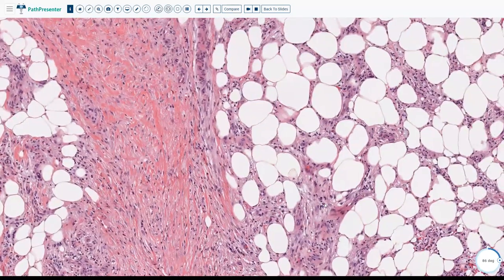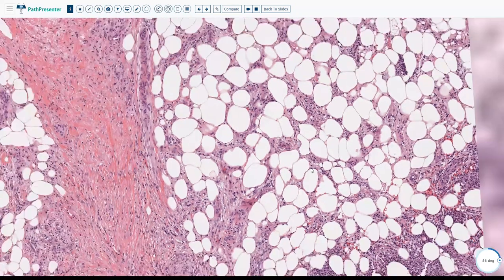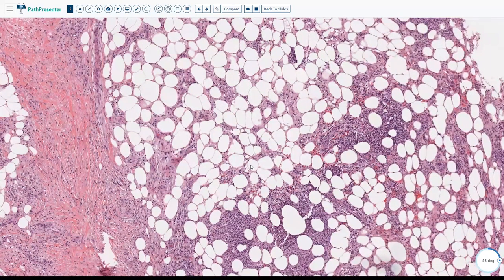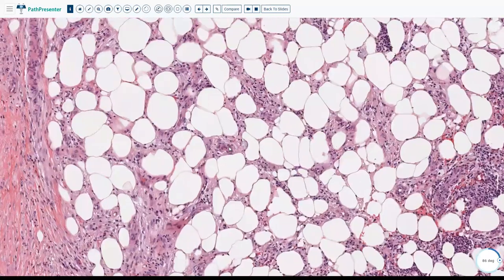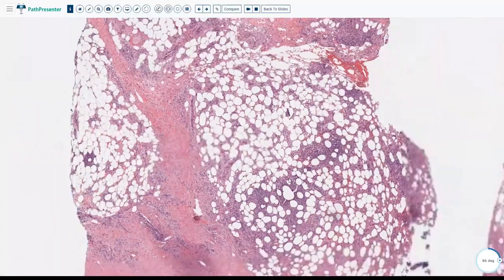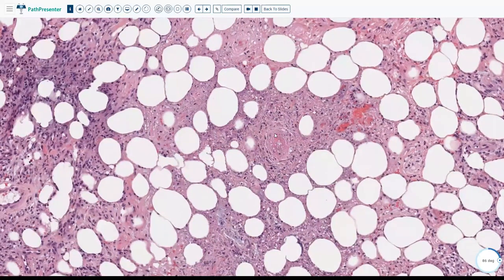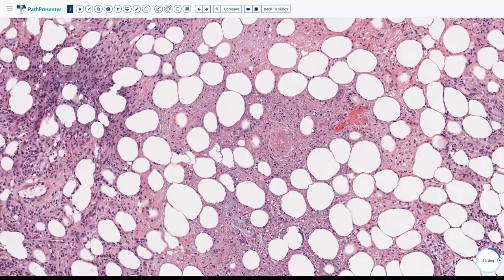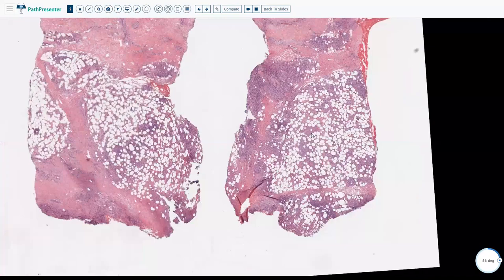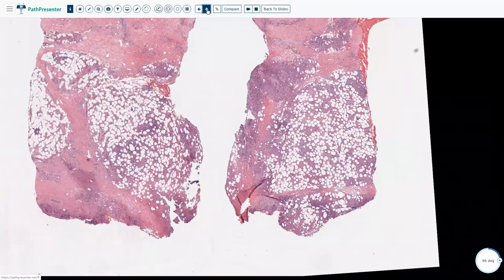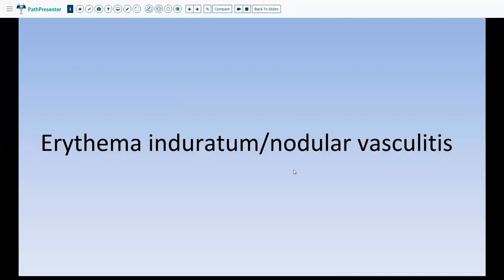When you see neutrophils associated with a lot of macrophages, you need to look for vasculitis. Going to high power, there is actual vasculitis with fibrinoid degeneration around the vessel wall and fat necrosis. So with fat necrosis, vasculitis, neutrophilic infiltrate, suppurative and granulomatous inflammation, and lesions at the back of the legs, you have to think of erythema induratum, also known as nodular vasculitis, especially with the vasculitis present.